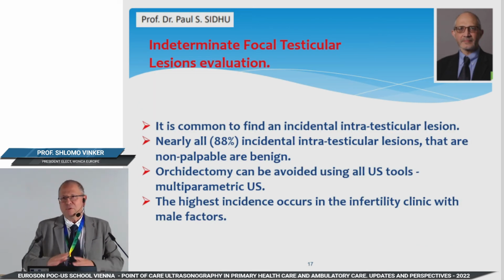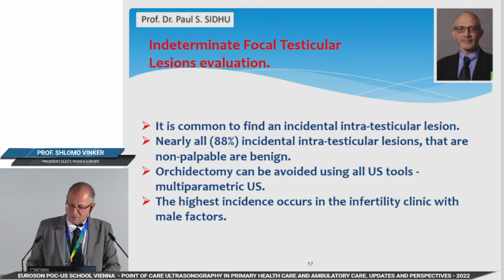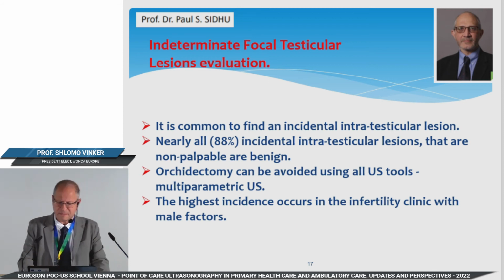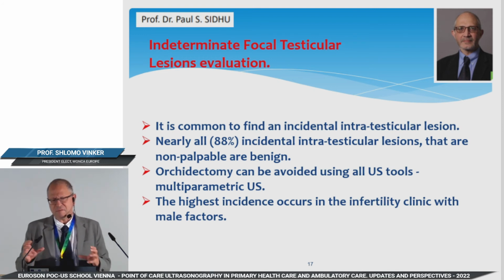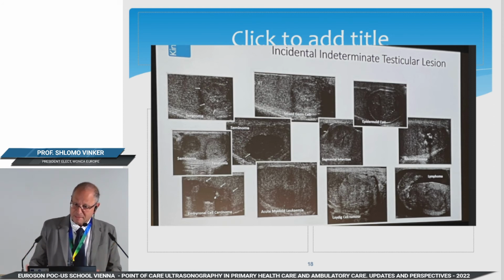And then we moved to another organ, the testicle, and we looked at a very specific problem, a very specific area of the diagnosis of small, maybe incidental findings in the testicle. And again, it is a very narrow area, but again it opened the window to testicle ultrasound.